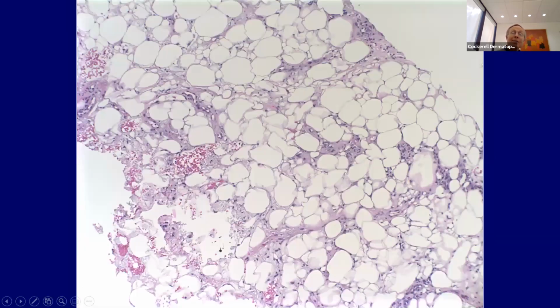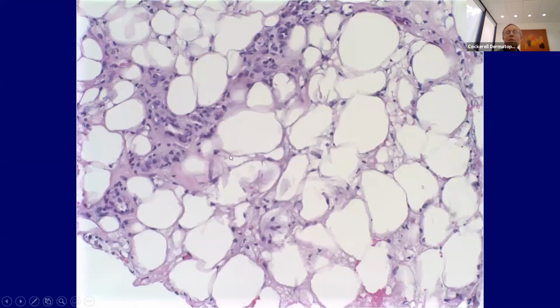And if you look at the fat, you see the classic membranous fat necrosis, the little wispy appearance to the fat here, the somewhat edematous, almost mucin-like deposits in the fat with these small globules. These are little fat microcysts here with variable amounts of inflammation. So this is the classic membranous fat necrosis that you see with patients that have hypodermitis sclerodermiformis or sclerosing panniculitis. There can be some secondary inflammation here.